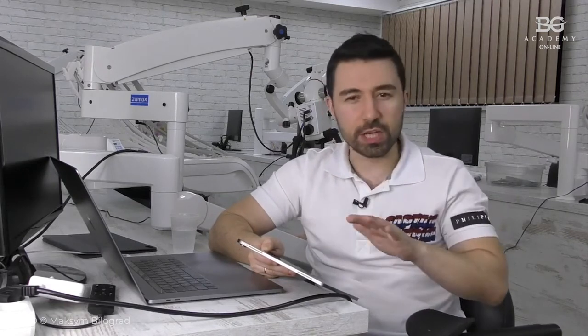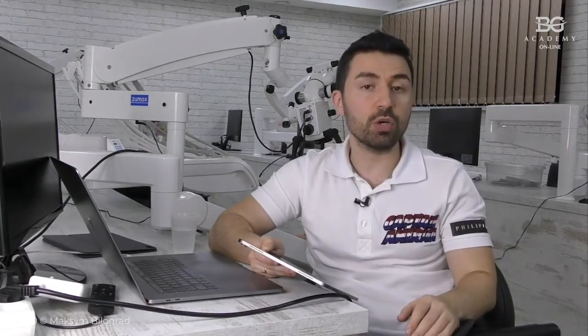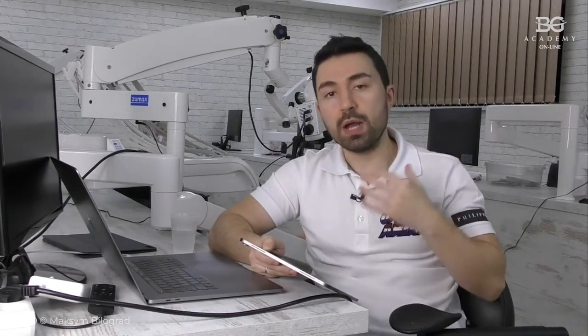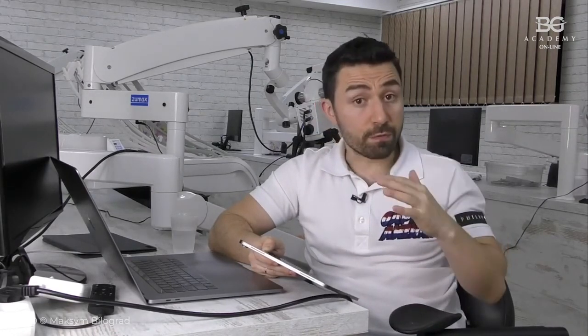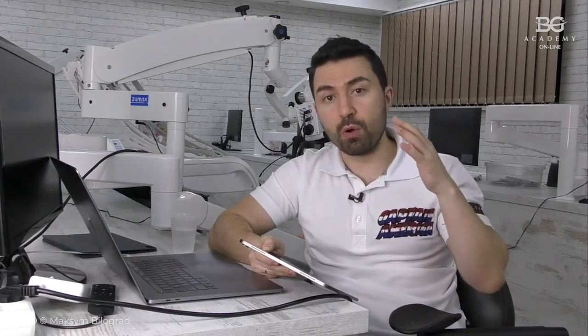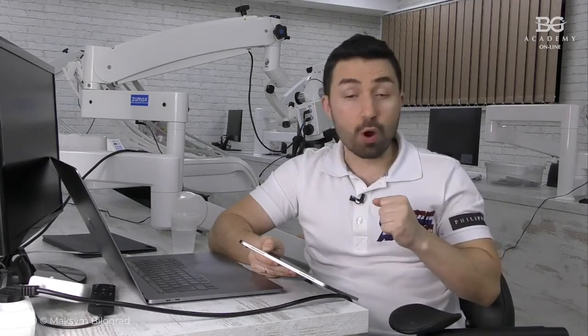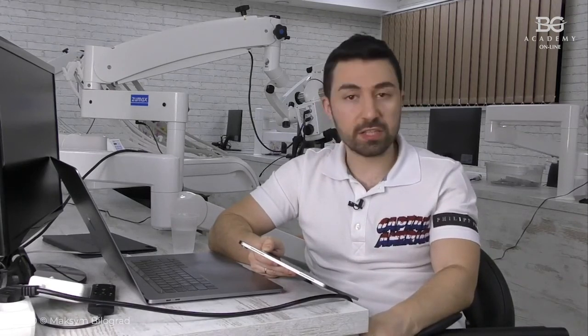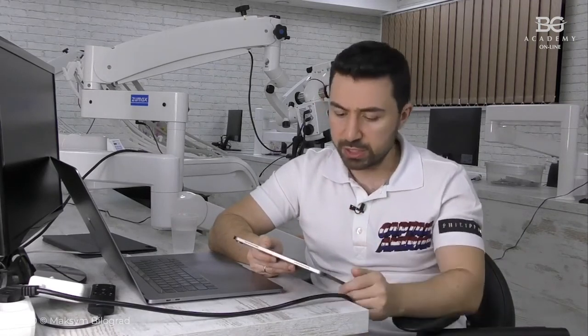It helps my dental technician understand where to finish and where to start the veneer. And for me also, I will get a really good emergence profile, good position of the veneer, and the ability to control the process of cementation, etc. So I prefer to do some finish lines.